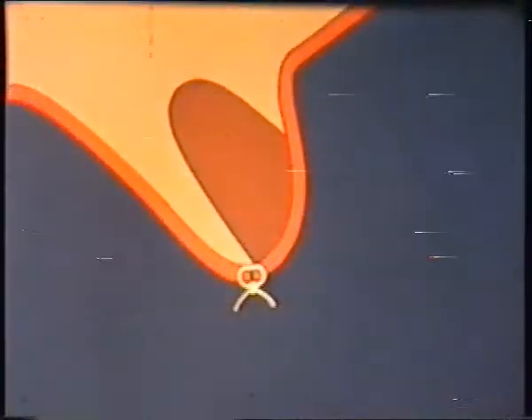If the fit of the template is satisfactory, the labial flap is sutured to the mucoperiosteum of the palate.